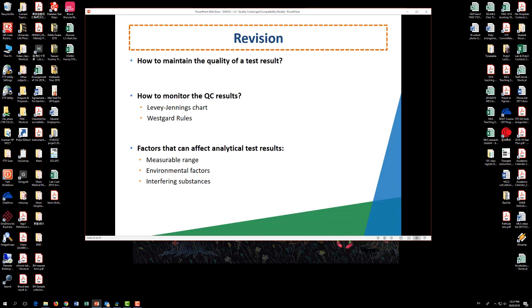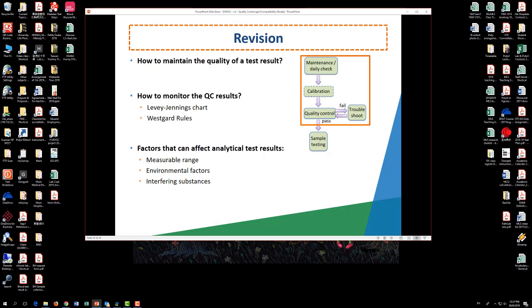In this lesson, you learned how to maintain the quality of the test results and how to monitor the QC results. Finally, you should know that there are some factors that can affect the analytical test.